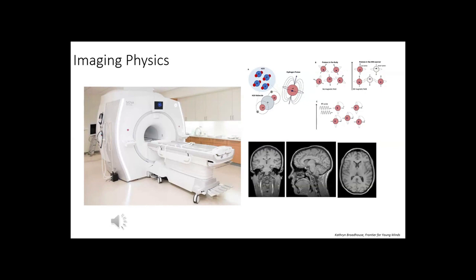Okay, so before this MR technology came out, we had no way to study the brain. The only thing we could do was talk and then try to guess what's going on in the brain. Okay, now we have this MR machine. The MR machine is nothing but a big magnet.